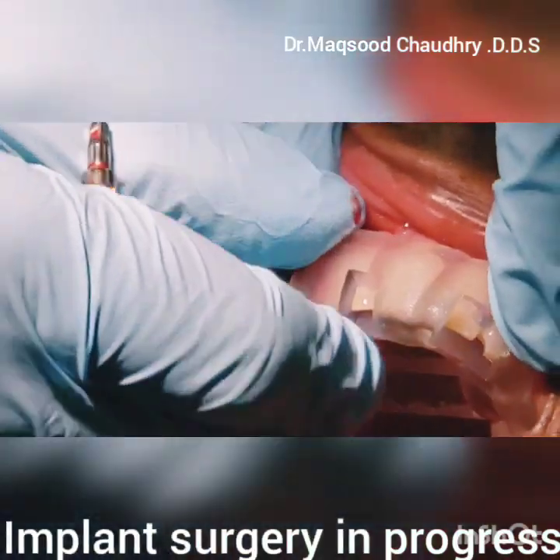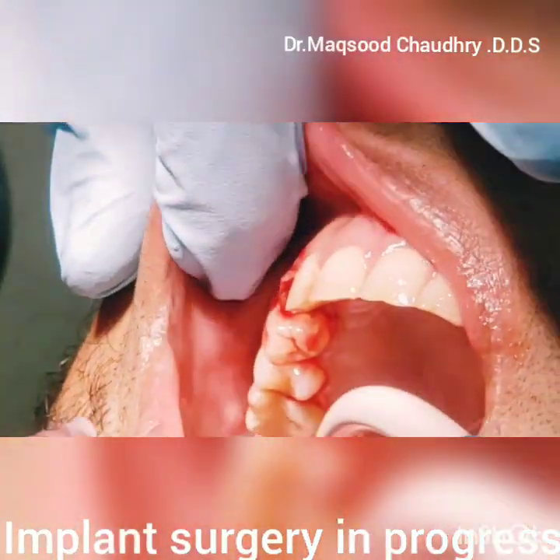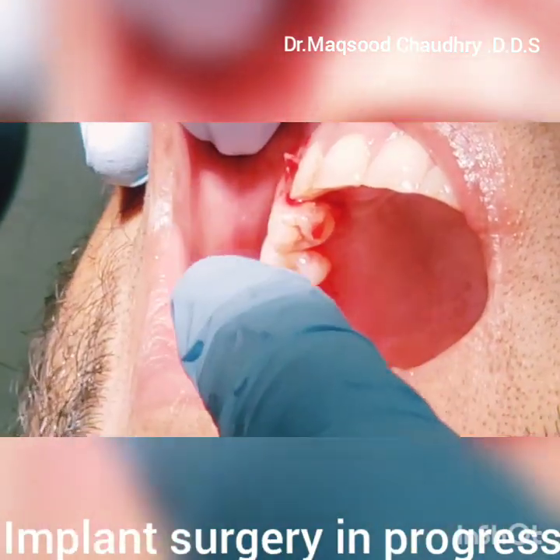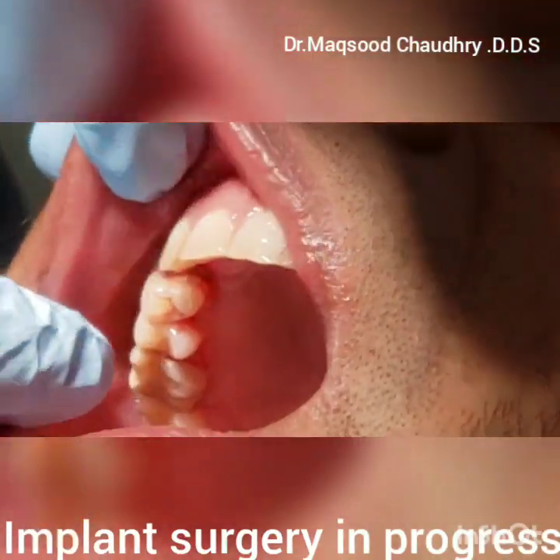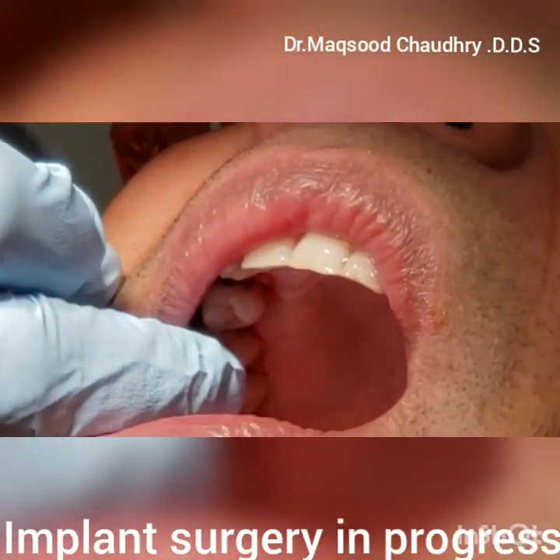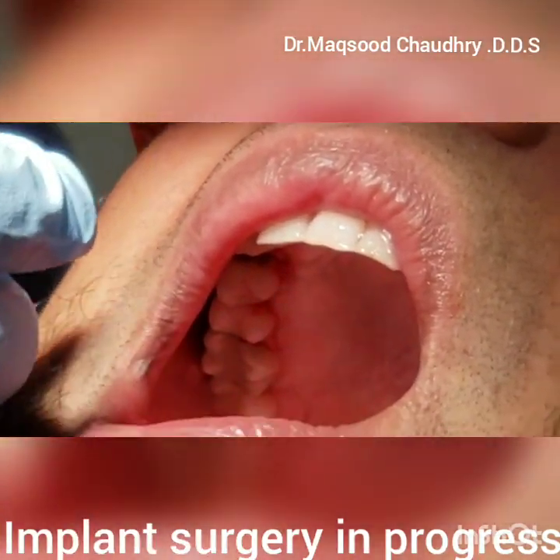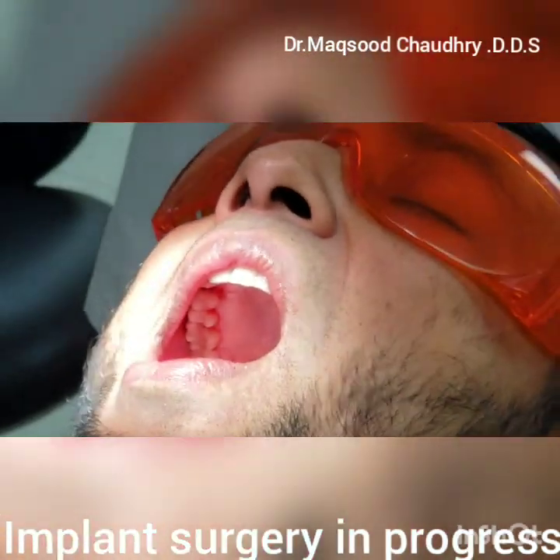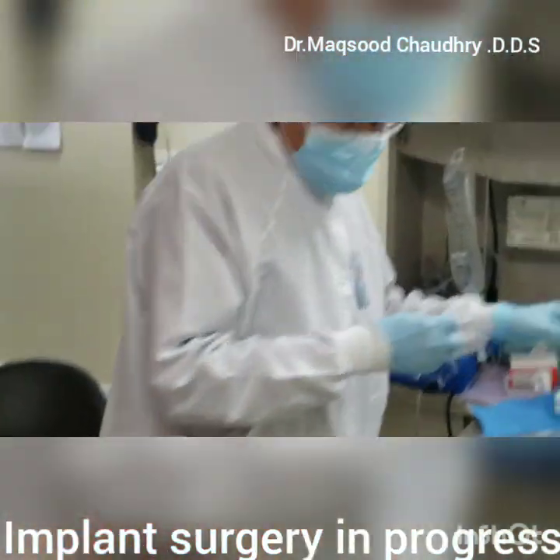And remove this guide. Implant body is in. Then we will take one X-ray to verify. Okay, let's take the X-ray now.